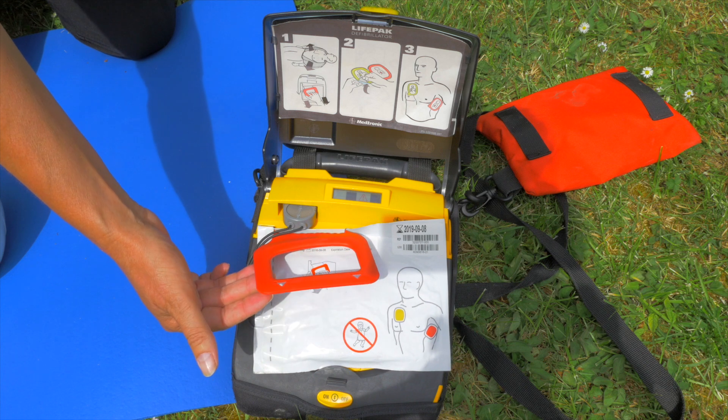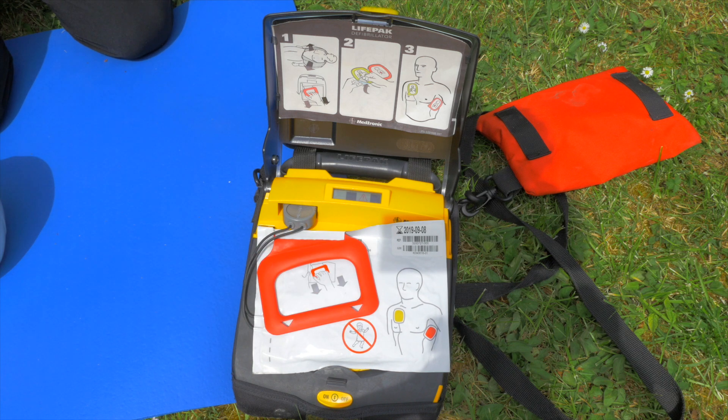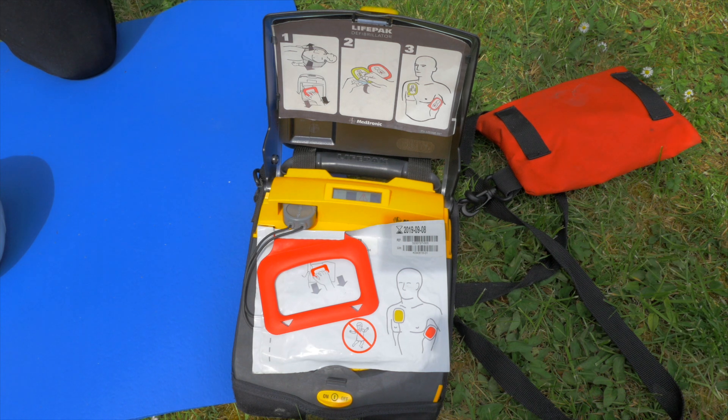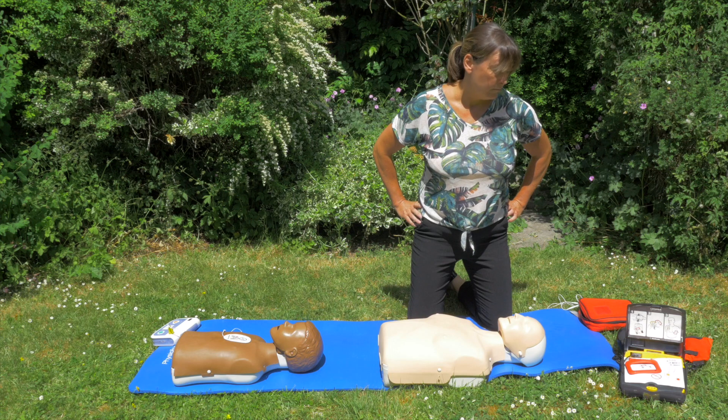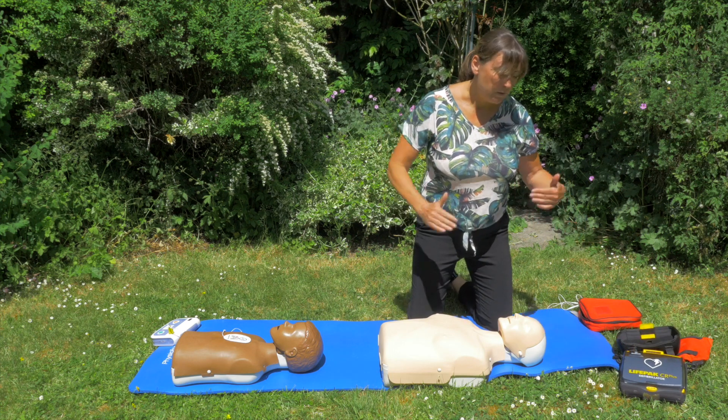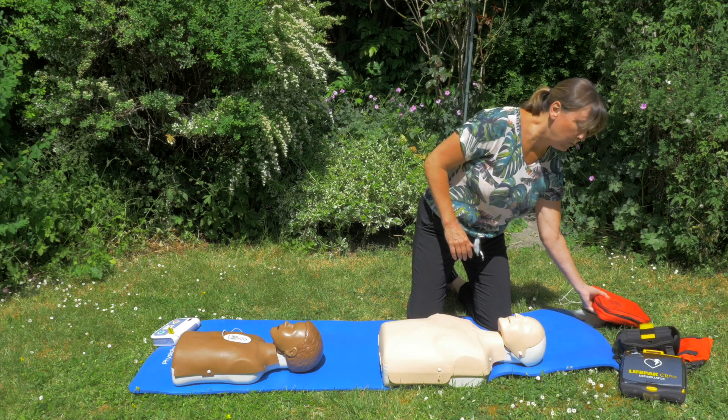The device will instruct: 'Pull red handle to open bag.' Obviously we're not going to do that because this is a real one. It will then say 'Look at pictures on pads,' 'Peel one pad off blue plastic,' and 'Apply pad to bare skin exactly as shown in the picture.' That will just keep repeating because we're not progressing that one forward.